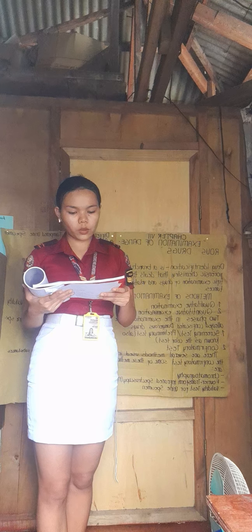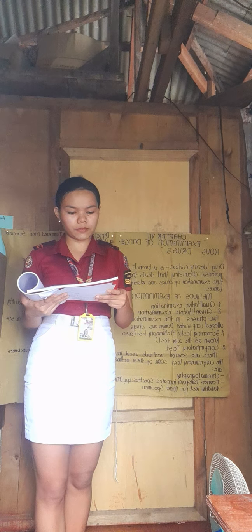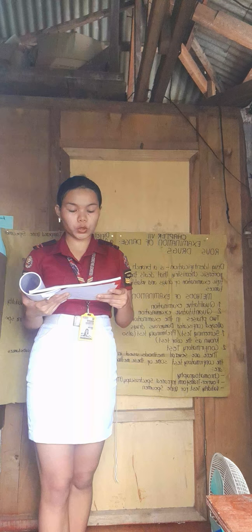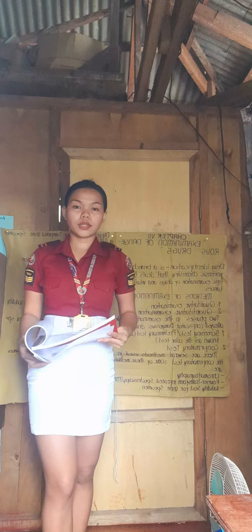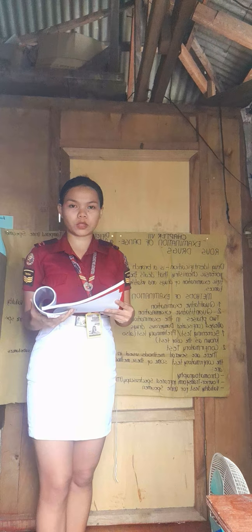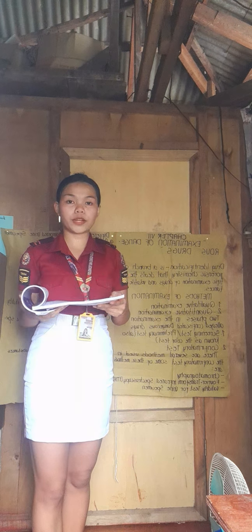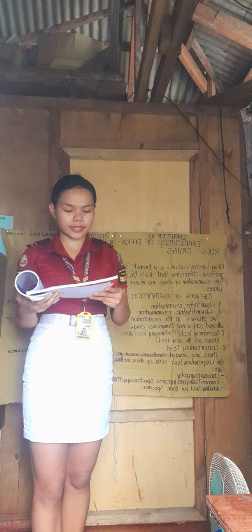It must also be noted that only those specimens that yielded presumptive positive results are subject to confirmatory tests in order to confirm if the positive result of the screening test is really positive. So, second is confirmatory test. So what is confirmatory test? It is the method employed to confirm the results of the screening or preliminary test.